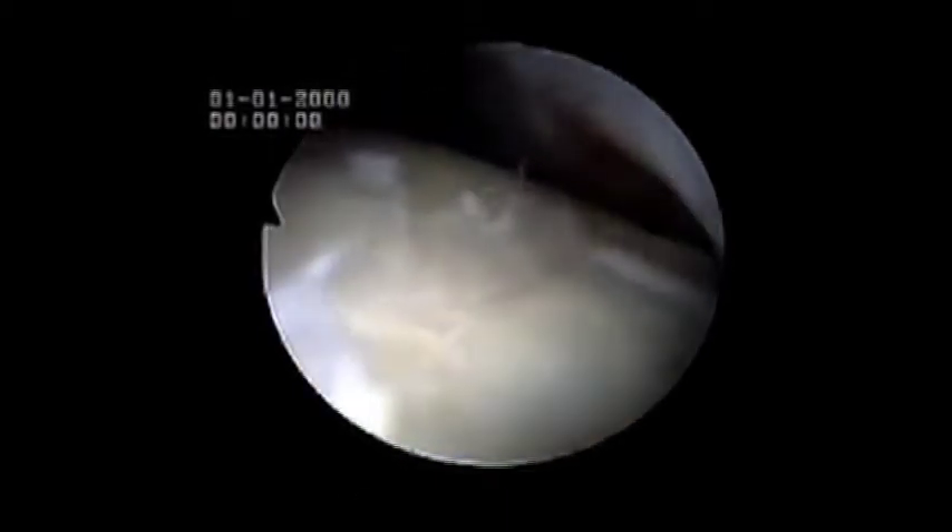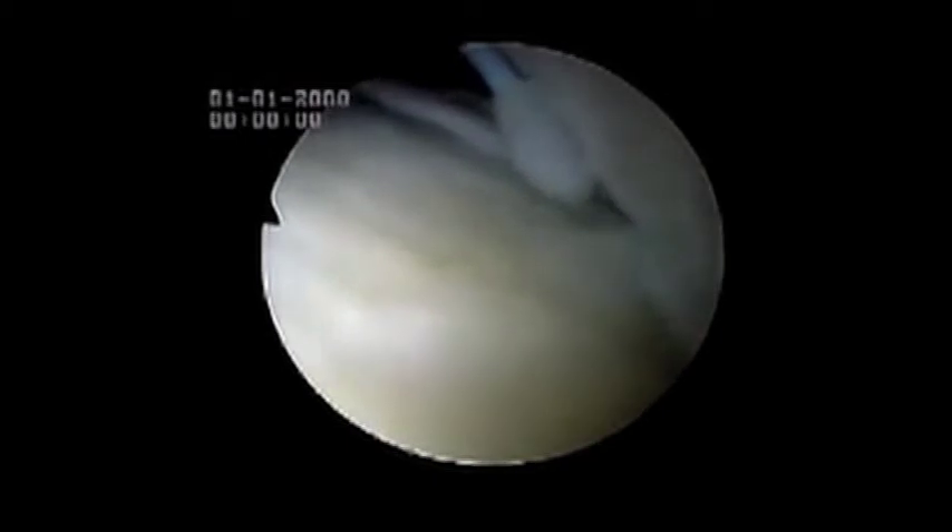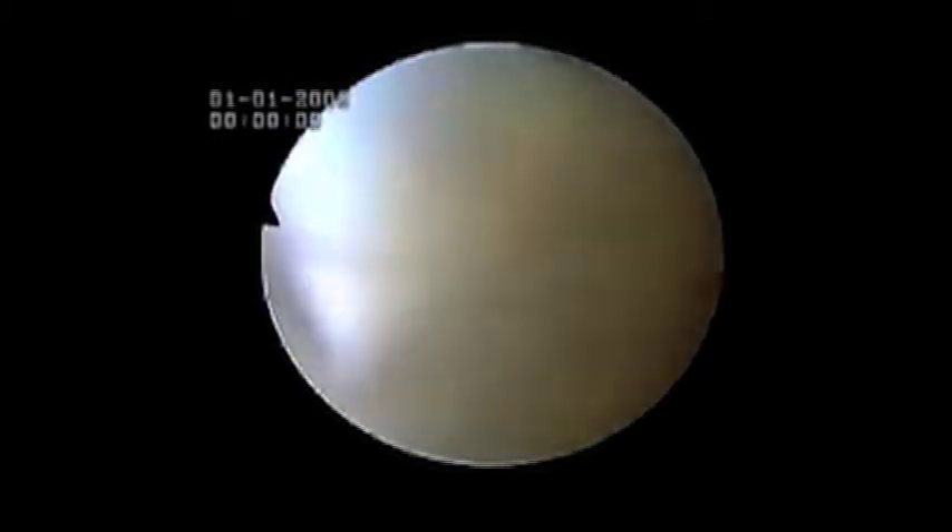The instrument being used to resect the band is a 3.5mm gator resector. It normally takes some minutes to remove this dense fibrotic tissue piecemeal. Associated with this dense fibrotic tissue is also synovitis, which is the reddish tissue you can see in the background.